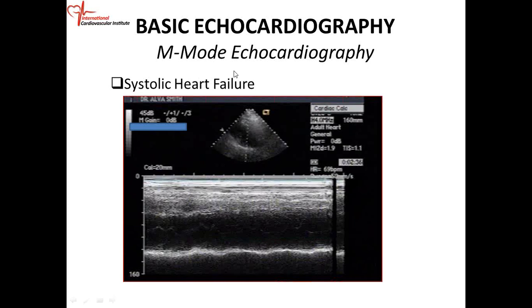But if you have difficulty, work from first principles: two-dimensional echo on top, cursor is right there. The cursor passes through these structures, okay? So you have the chest wall, the pericardium, RV wall, RV cavity, septum, LV cavity, posterior wall, left atrium. So these are the structures.